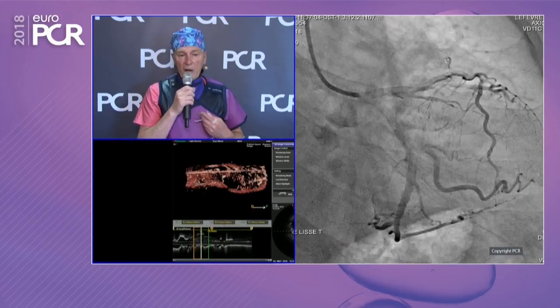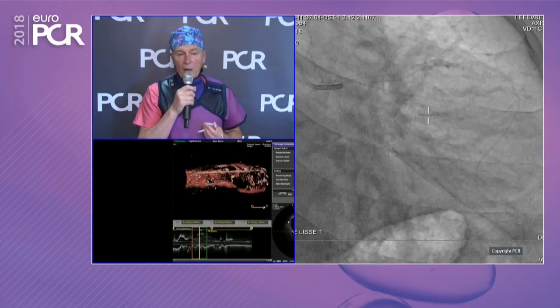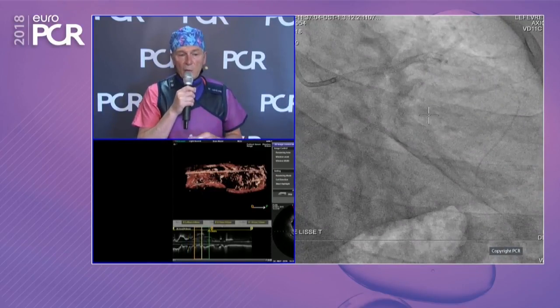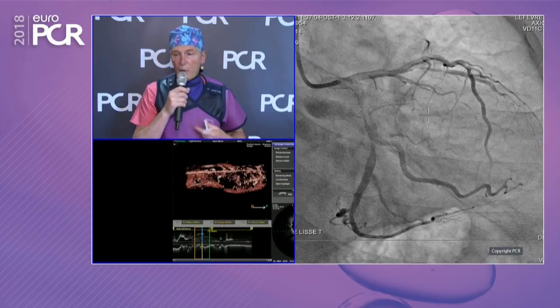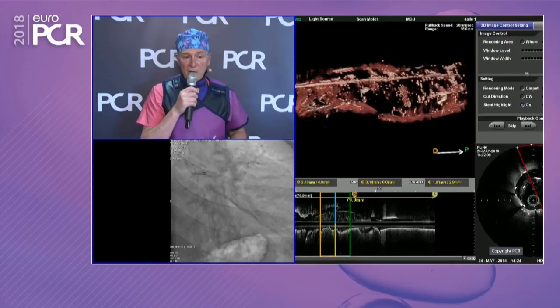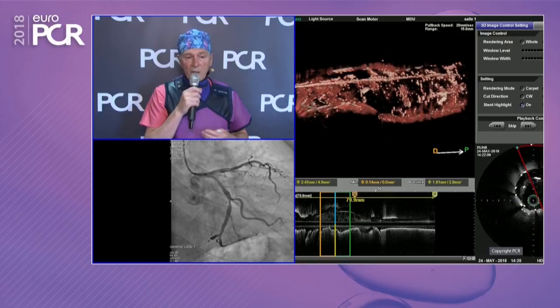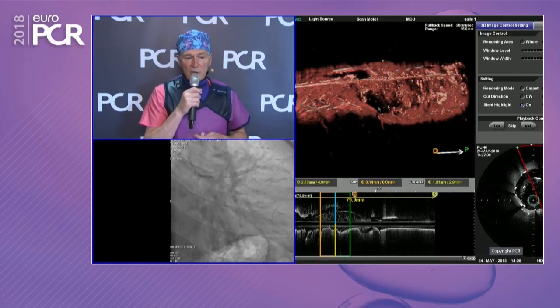It's an area of high shear stress, or the area where we have a low risk of atheroma. If you displace the carina, you will have at follow-up, sometimes midterm follow-up, problems in one or the other branch. So I think it's very important to have the carina at the right place. So that's why we do a kissing balloon inflation.